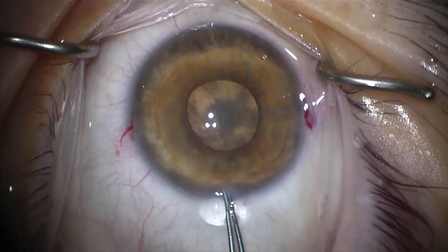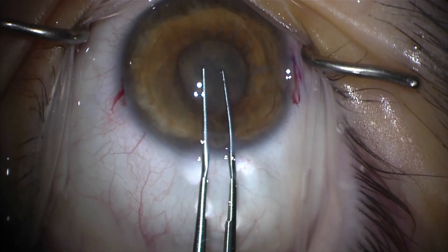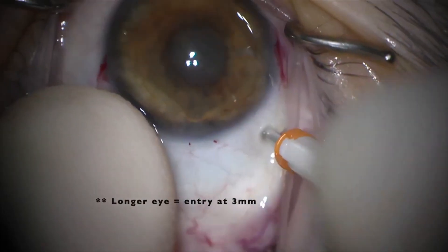Due to the shallow chamber, it was difficult to introduce instruments into the eye for phacoemulsification. To solve this problem, we decided to perform a limited anterior vitrectomy.